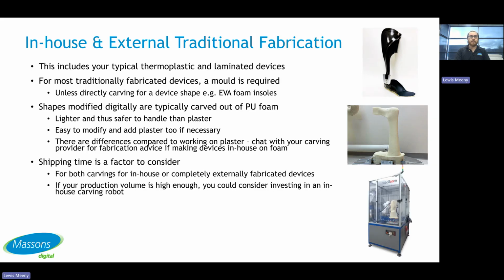One thing to consider though, is we talked about time and money. Shipping time is a factor to consider. And so that's both for if your carving is in-house or externally fabricated devices. If you're ordering carvings off-site to then fabricate in-house, you need to factor in the time that it's going to take for that carving to be made and shipped.